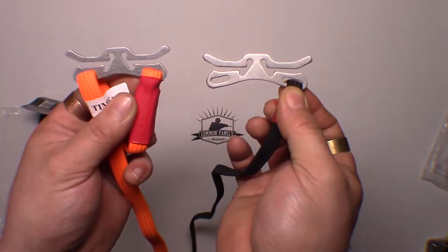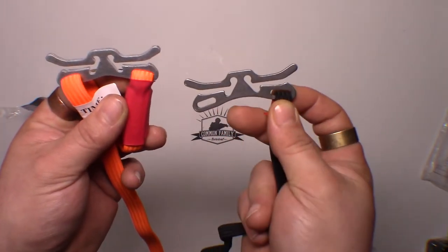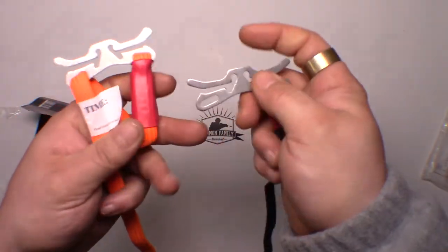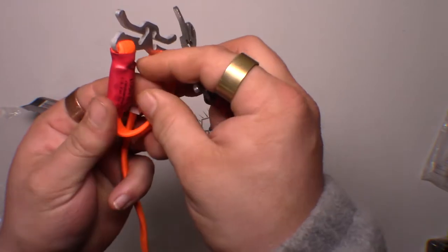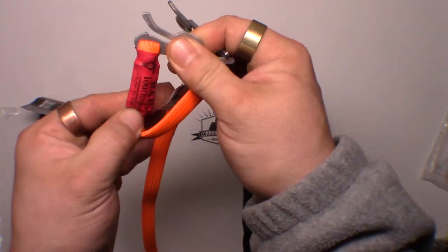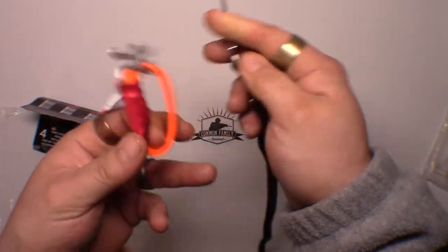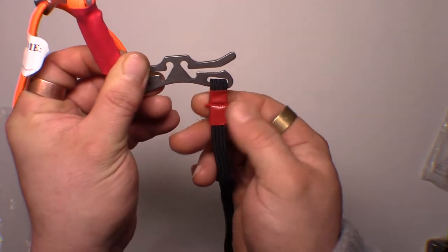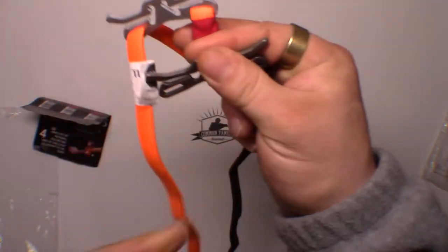The only main difference other than the thickness of the metal is this rubberized piece here. On the real one it comes all the way down about a good two inches, where on the Chinese one you've got about an inch, and it's sewn across there.